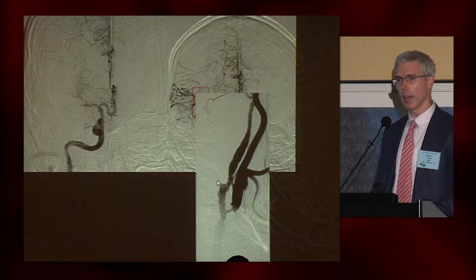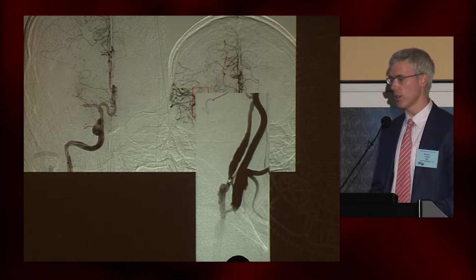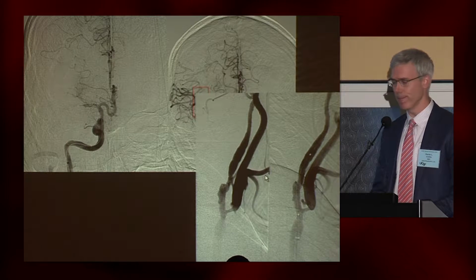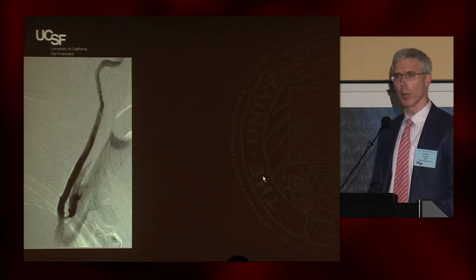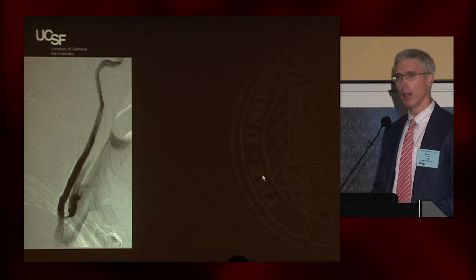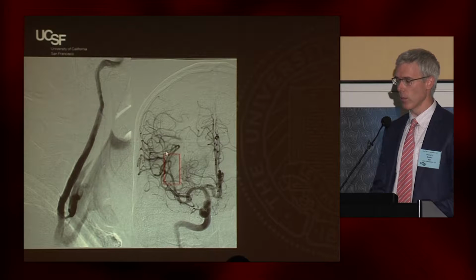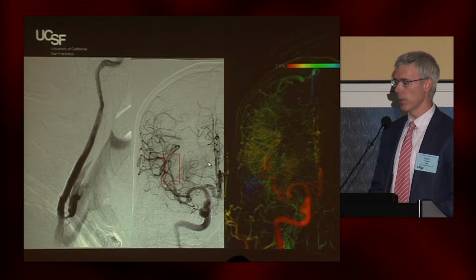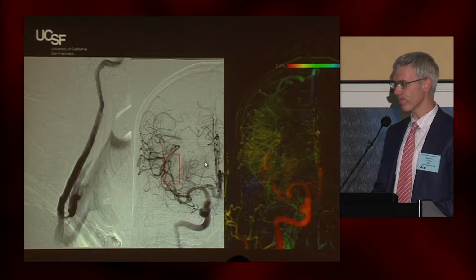But then we come down and look at the neck. So this patient has a fairly long segment atherosclerotic plaque. And to be conservative, in this case, what we did was angioplasty. We then gave the patient a couple of days to recover from their initial stroke, loaded them on aspirin and Plavix, and we stented the lesion. You can see now that this branch is filled completely, and then this is just a colorful parametric color-coded map to replicate that data.